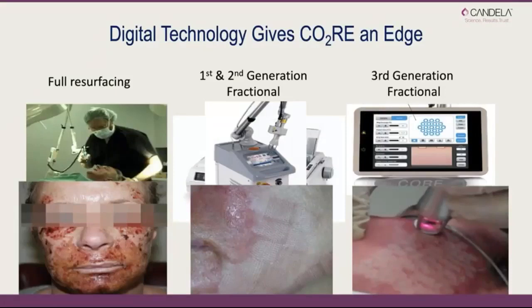We started off, of course, with full laser resurfacing. It's an effective treatment, but we have some limitations. One of the limitations, as we can see here, is a prolonged recovery time. And it's not just the epithelialization of the tissue. Many patients, and I found that it's particularly the skin types 1 and 2, can have prolonged erythema even after epithelialization, even for 6 months or 12 months, and it's not really predictable who will get that.